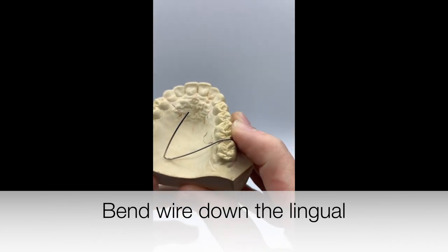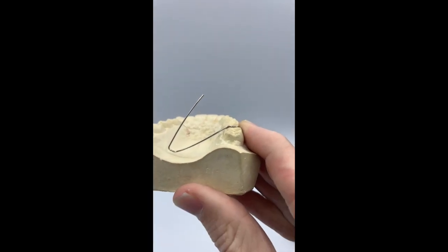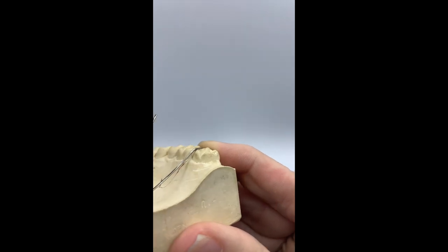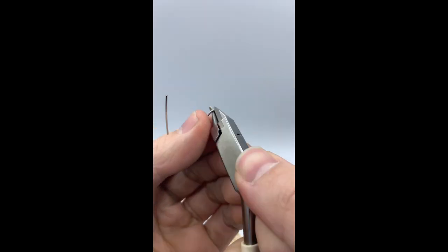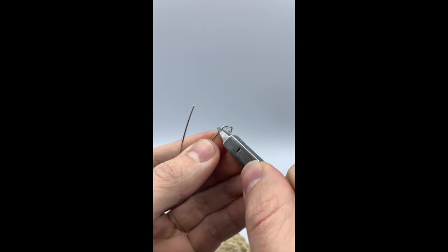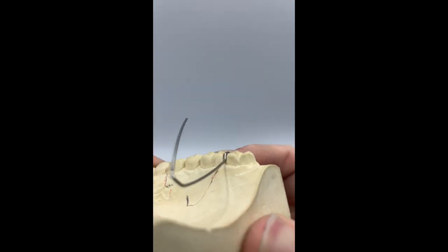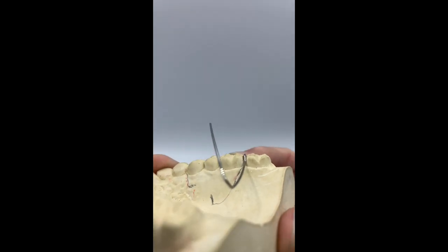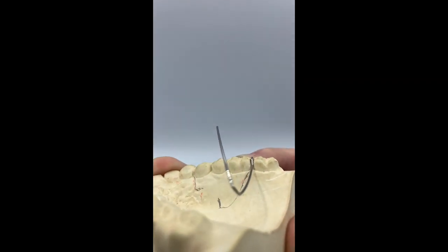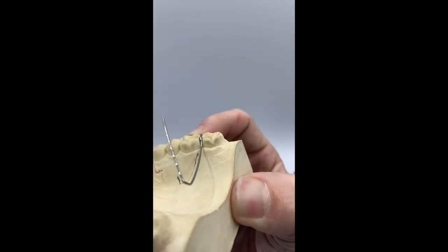When bending down into the lingual surface, we want to make sure we follow the lingual surface of the tooth downwards, almost so it fits like a little cap as seen in the picture above. The wire should fit nicely on the tooth with no space between the wire and the tooth.